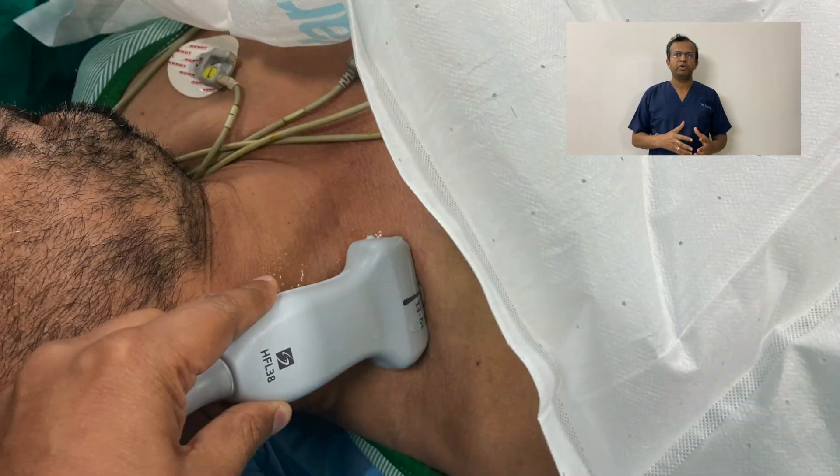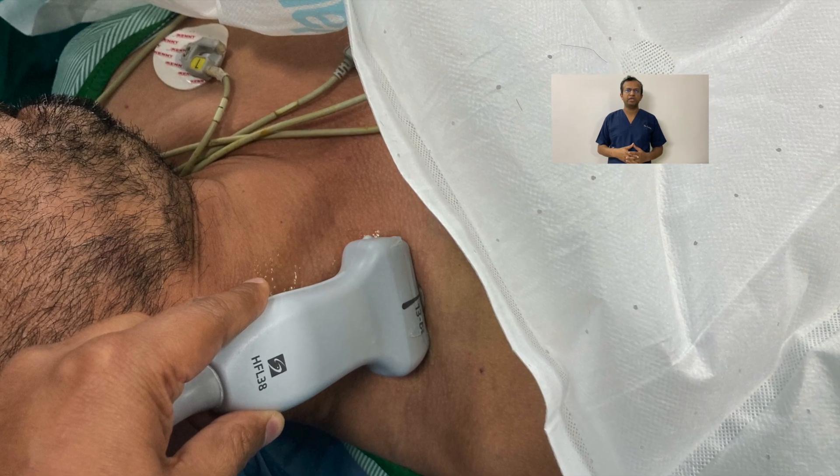To perform the supraclavicular brachial plexus block, the patient should be placed in the supine position and the neck should be rotated to the contralateral side of the block, and the arm should be adducted. You then place the ultrasound linear probe in the supraclavicular fossa, just above the clavicle. You can then visualize the pulsating structure, which is the subclavian artery, and just posterior to the subclavian artery you will see a bunch of grapes — that is the brachial plexus.